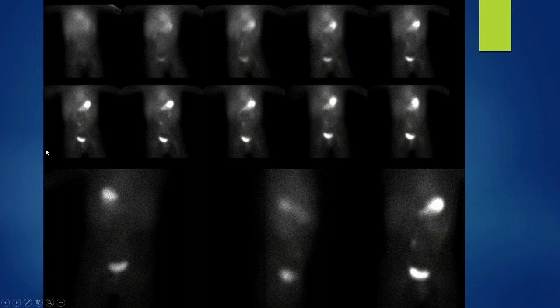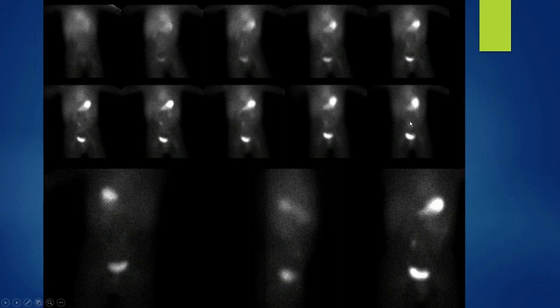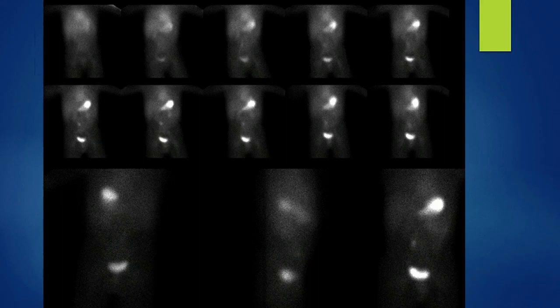Here is a Meckel's diverticulum case. In the early images tracer is distributed through the blood pool, then uptake appears in the stomach, and there's something faint that becomes increasingly notable over time. Posterior images don't help much, but lateral images show the activity to be anteriorly placed — most consistent with a Meckel's diverticulum.